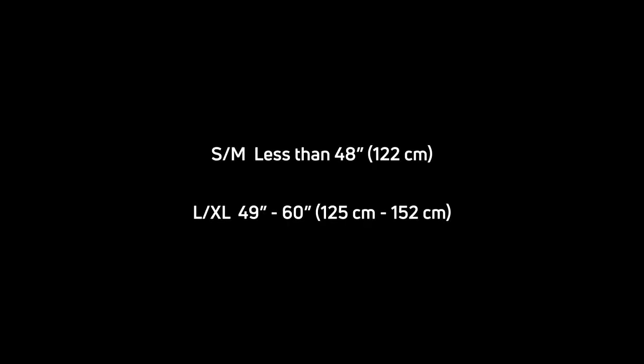Begin by measuring the circumference of the patient approximately one inch above the widest part of the hips. Match the patient's size to the sizing chart. If the patient's circumferential measurement is between sizes, select the larger brace.